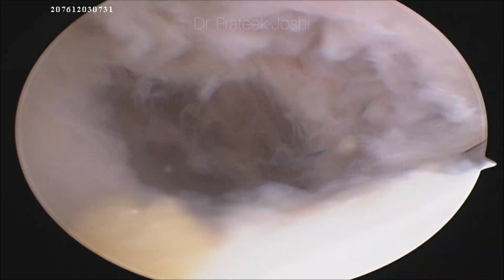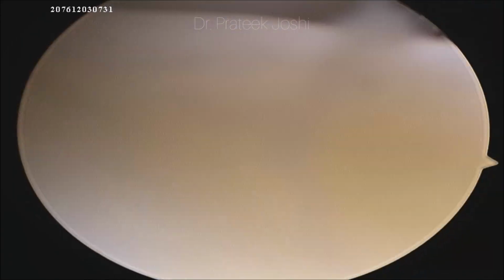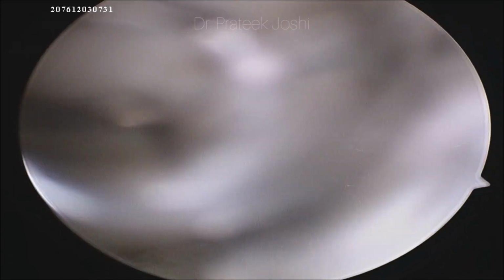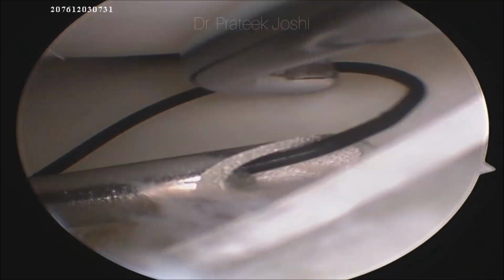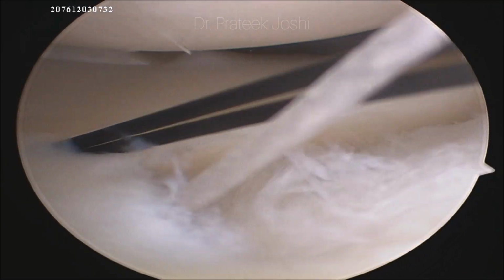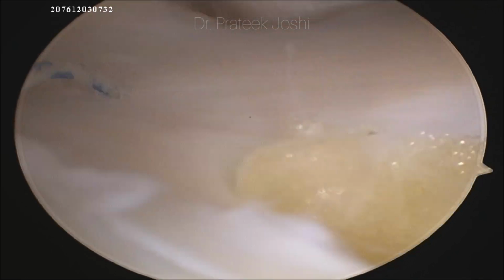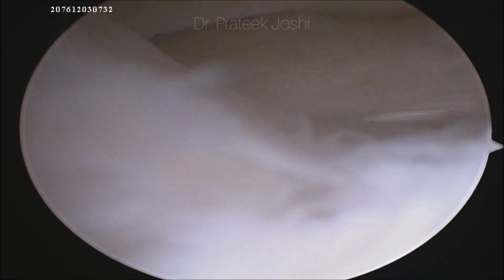For this outside in repair, I am using the spinal needle to shuttle the fiber wire through the meniscus. So this completes the second outside in suture.